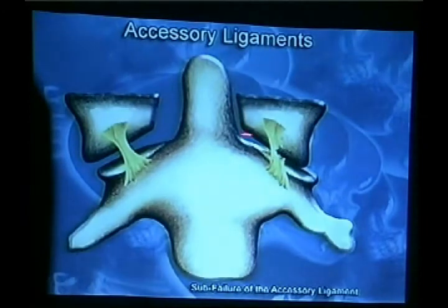Upper cervical ligaments, accessory ligaments hold C1 to C2. I'm going to sort of fast forward through this. C1 up here, I'm going to try to freeze this. C1 is not supposed to hang off C2, 5 millimeters, right there. Her head, she said, felt like it wasn't attached. This C1 is hanging off almost 5 millimeters right there. Remember when I shook my bones? This is that patient. Headaches all the time. No one can figure out what's wrong. C1 is sloppy all over the place. We can see the patient, sent the tape in, they pay the bills or settle the case.